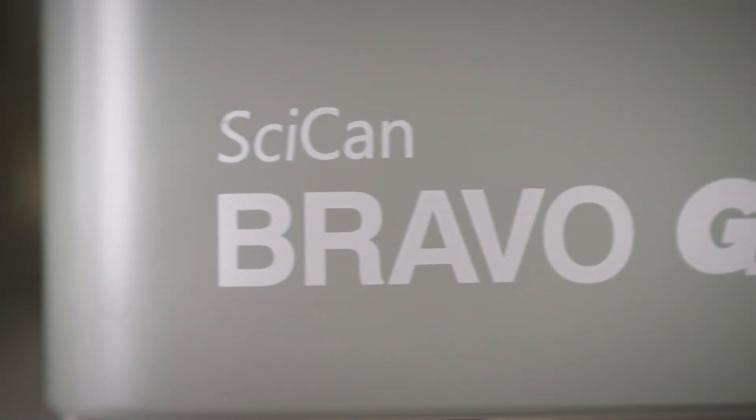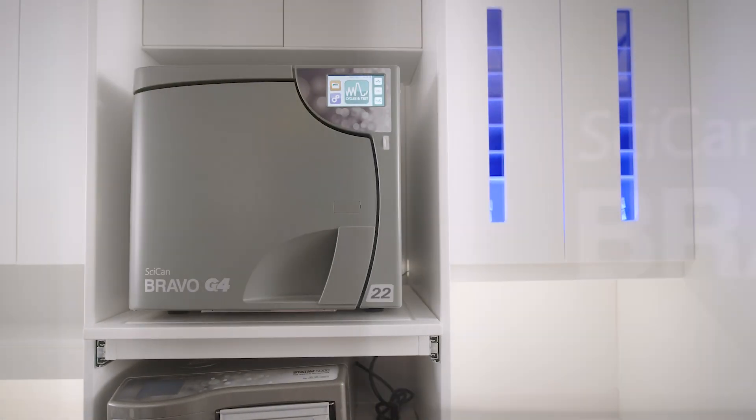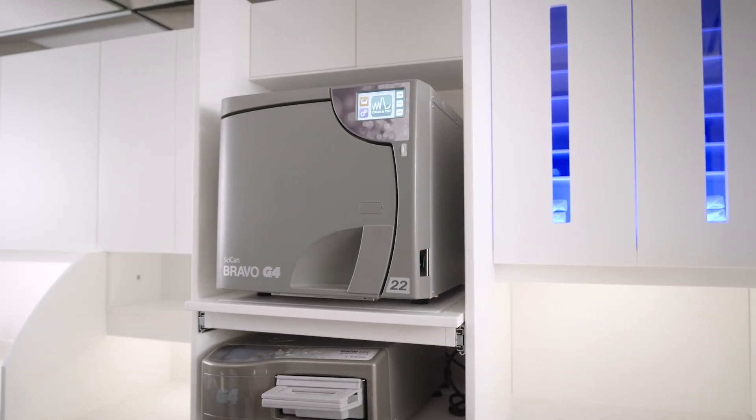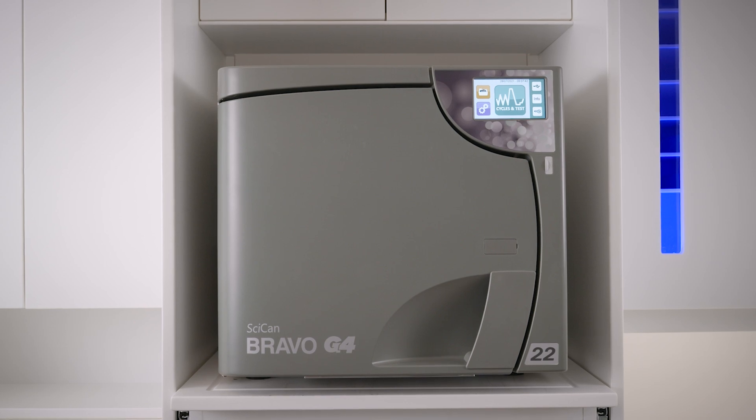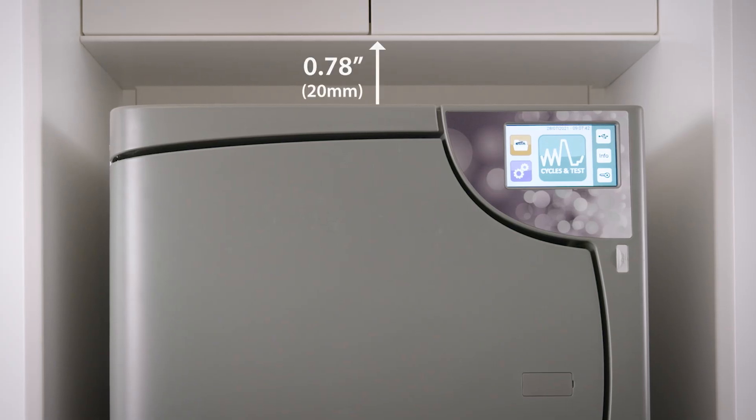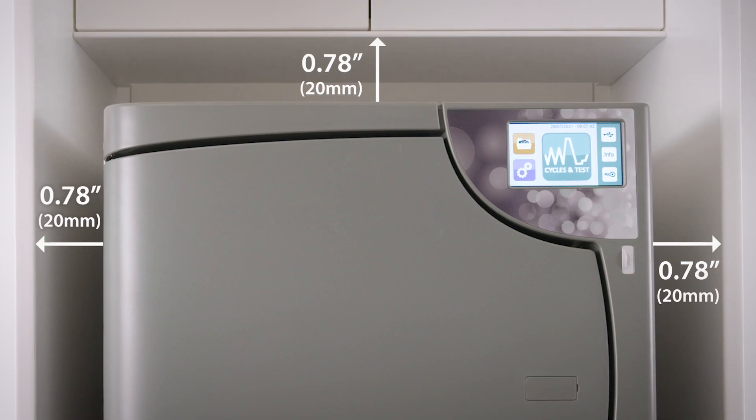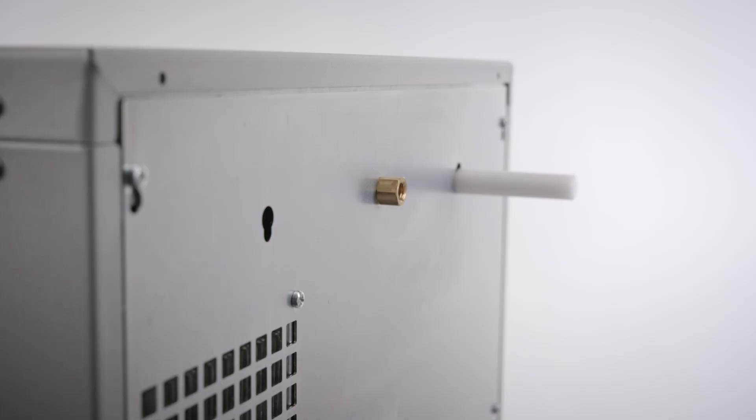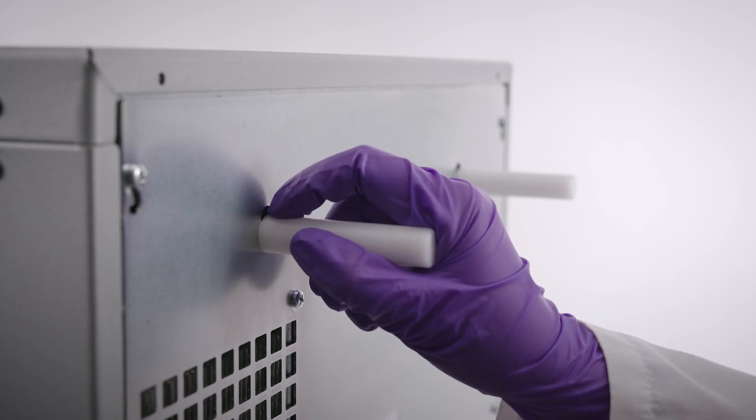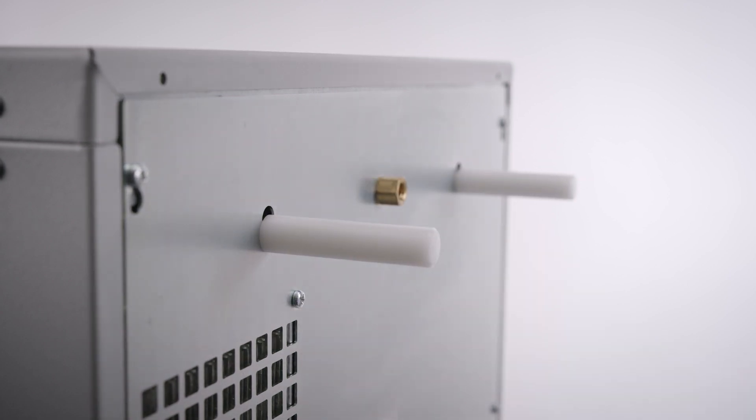When installing the Bravo G4, ensure there is adequate space around the machine to provide effective ventilation, including 20mm or 0.78 inches space for the top, left and right sides of the machine, and 70mm or 2.75 inches space at the back. Spacers are provided with the unit to ensure proper spacing at the back.